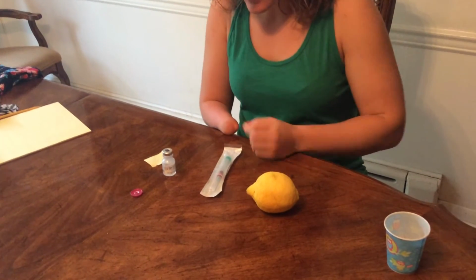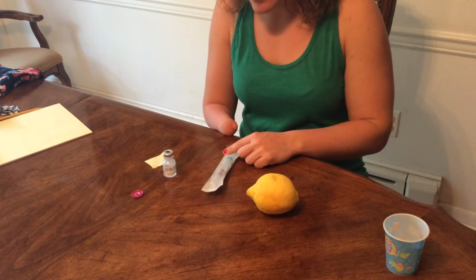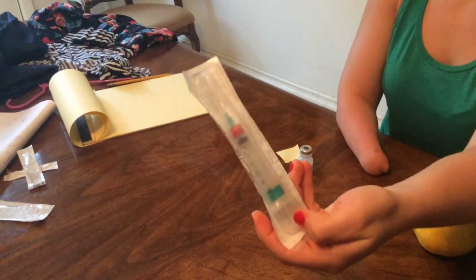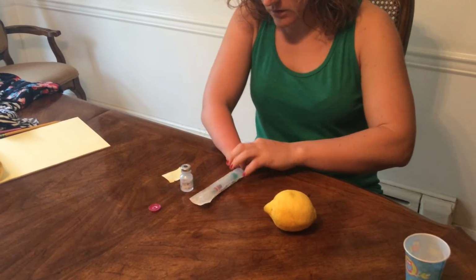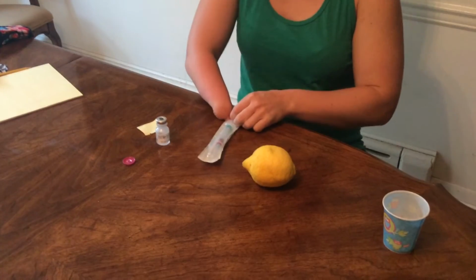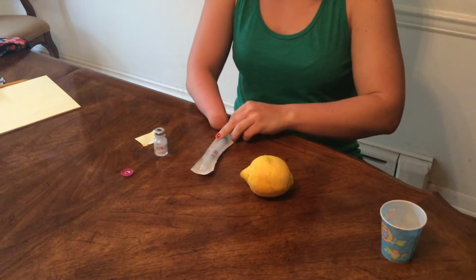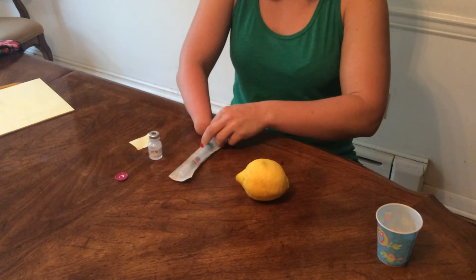Okay. The next thing is the needle, and the bottom of the needle here. That part you try not to touch, but the needle especially itself is sterile. Okay. So we're going to open up our needle. This is an IM needle. It is 23 gauge, 1 inch. So you use this for intramuscular injections. A 5/8 needle is what you use for sub-Q.